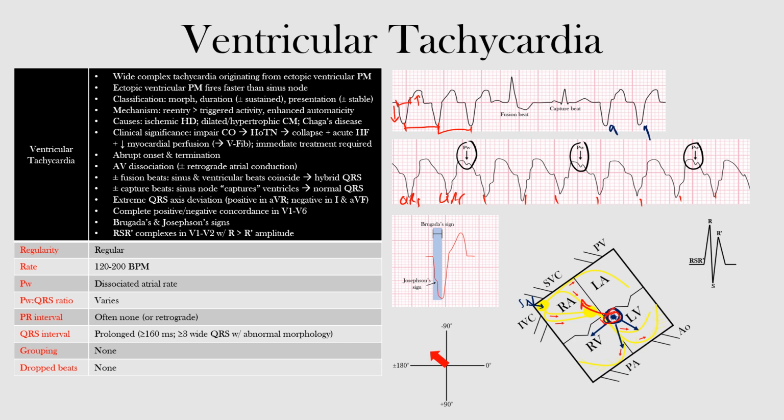Now, another clue that is helpful for diagnosing VTach is the presence of capture and/or fusion beats. A fusion beat, which is also known as a Dressler beat, occurs when the sinus and ventricular electrical impulse occur simultaneously and produce a complex of intermediate morphology of the QRS, okay? So in this case, let's just erase this here and imagine that we have our sinus node that fires and we're able to get down our conduction pathway, but also we have this impulse in our ventricles that's also firing, okay? So we have both of these combining and causing a hybrid morphology of the actual complex.